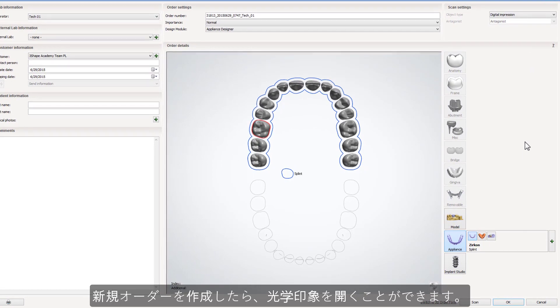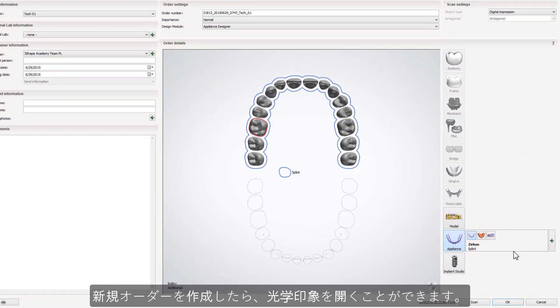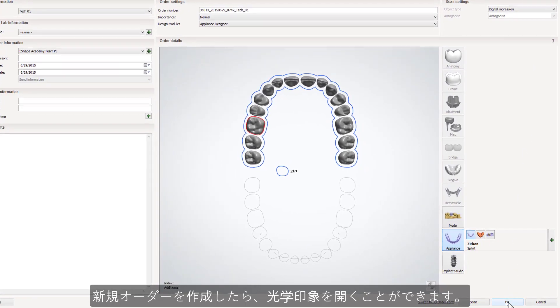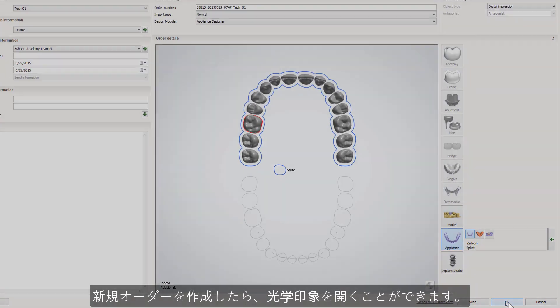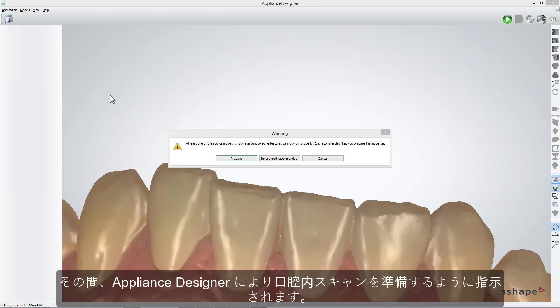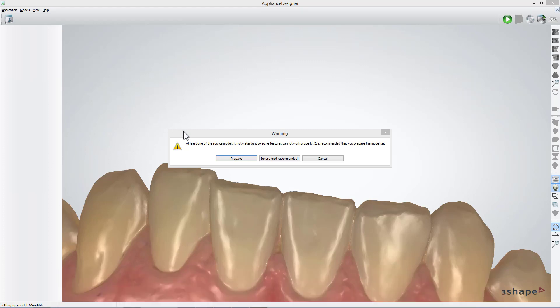When new order is ready, you can open the digital impression. While doing that, appliance designer will ask you to prepare the intra-oral scans. Click Prepare.